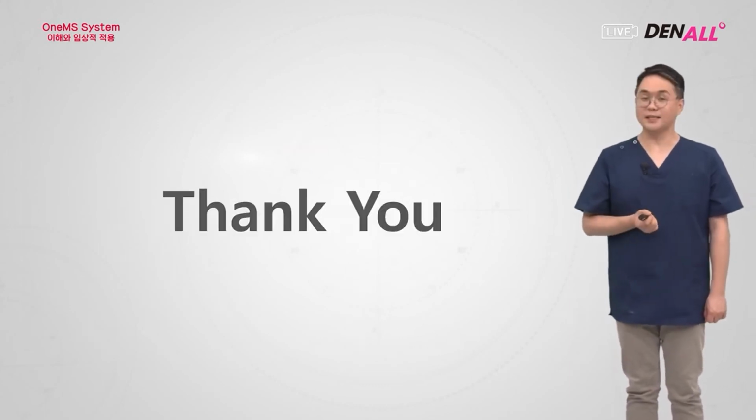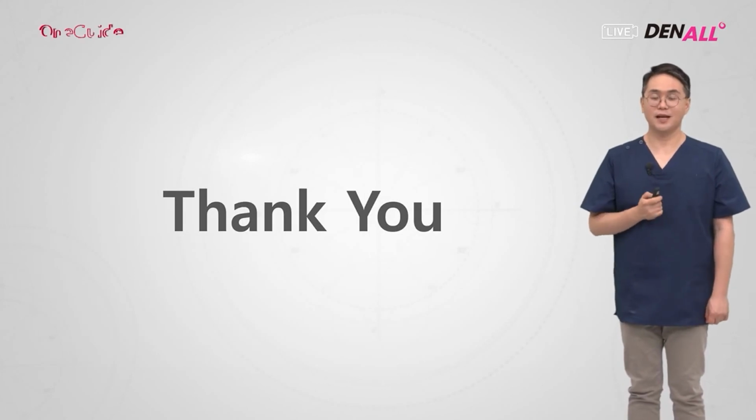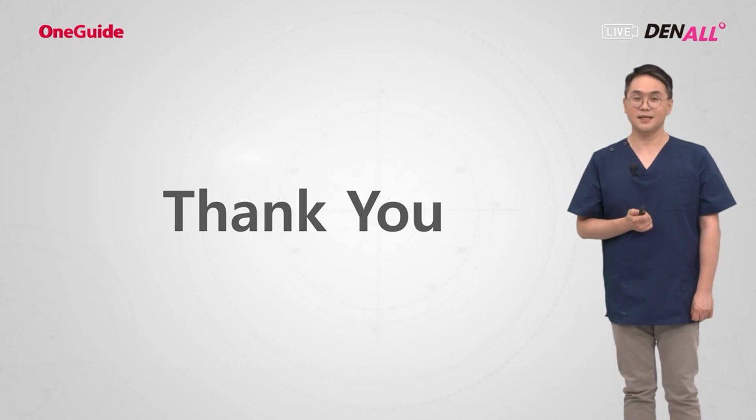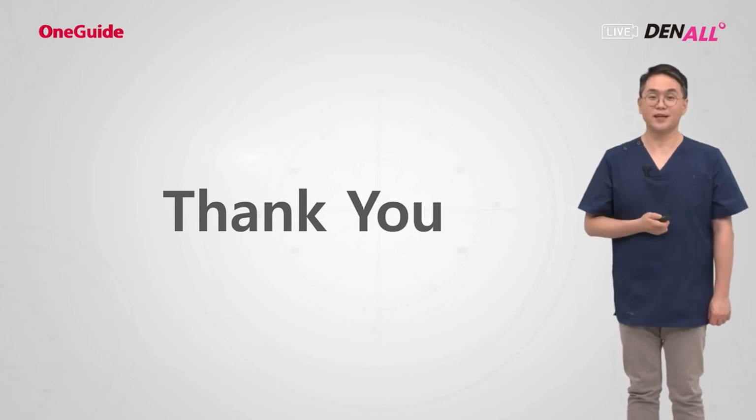Now, up to now, I looked at how to use the digital guide surgery system on the anterior part, and I will see you at the next session. Thank you.